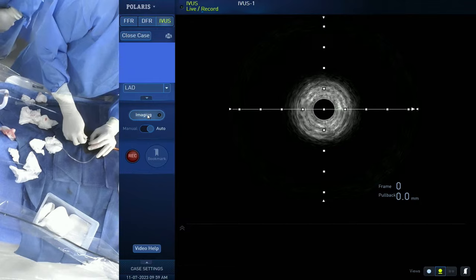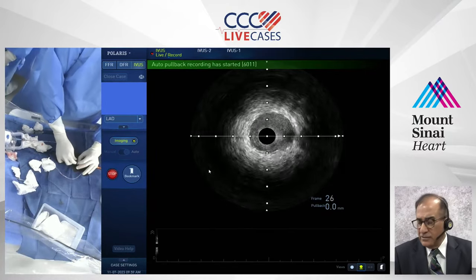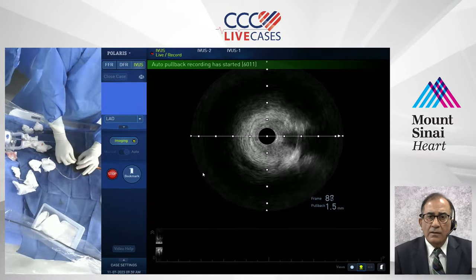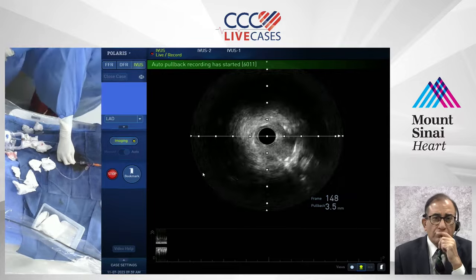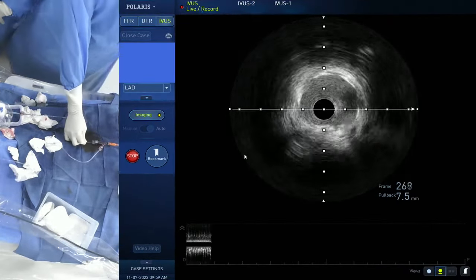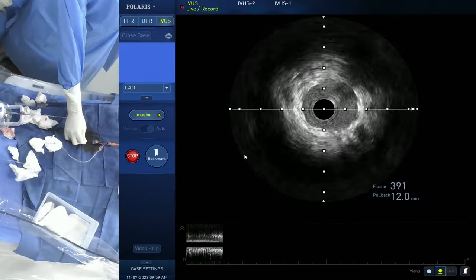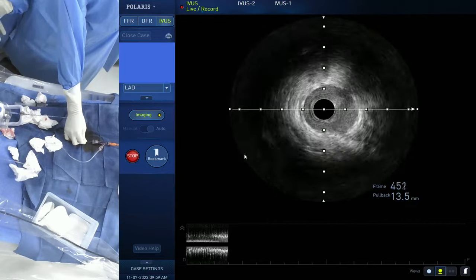No, that could be, probably in more eccentric cases. I think what happens is the perforation is happening, and then as soon as you place a stent, it becomes frank and opens up. This is the distal part of the stent. But we have had a few balloon ruptures of the IVL, which caused some dye staining, you know, type A.